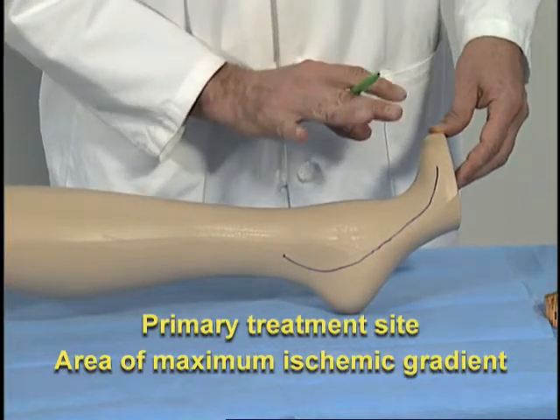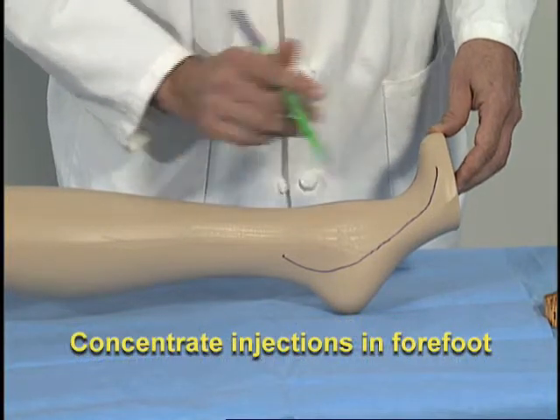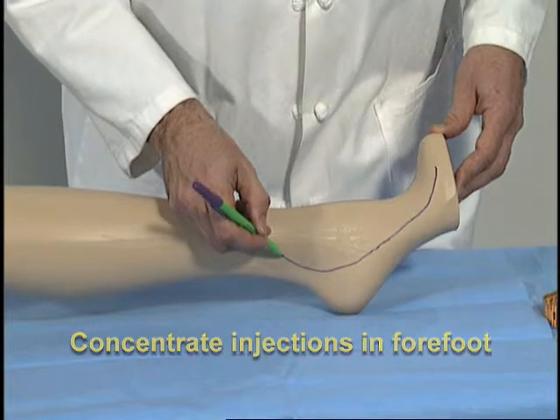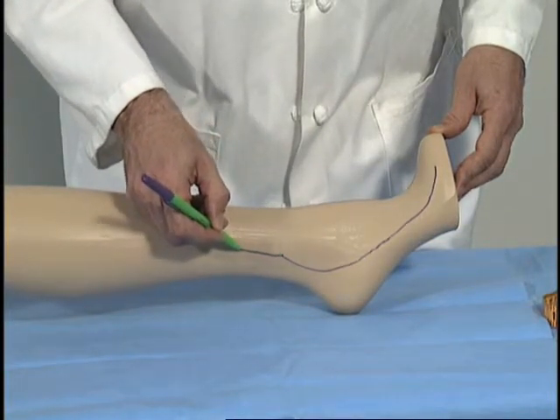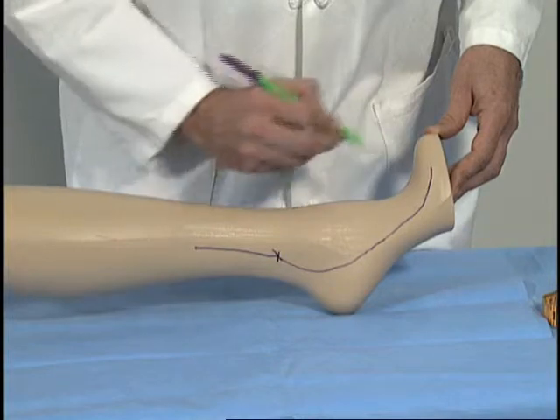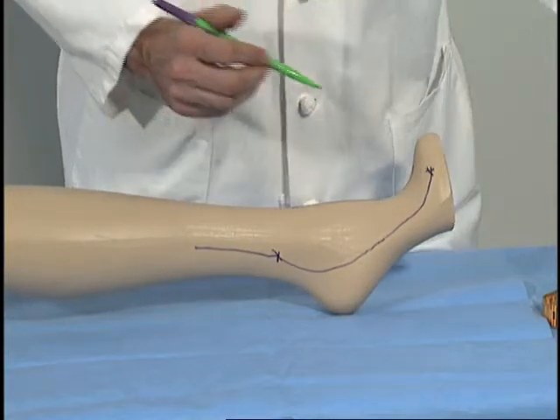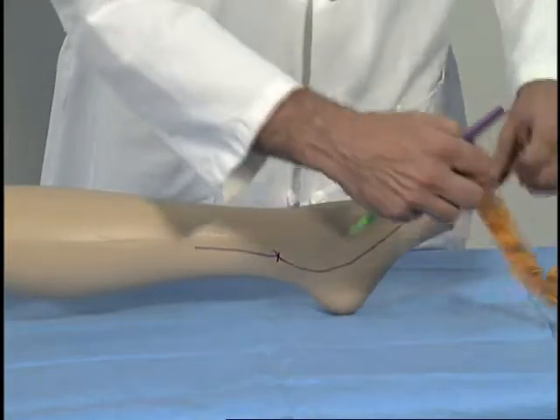This is forefoot ischemia, and we want to concentrate our injections in the forefoot. If we find that we have additional capacity to use our 40 injections, we can continue up along the posterior tibial, but remembering that the forefoot is the primary target. So we'll mark out our primary targets. We'll bring our measurement in.